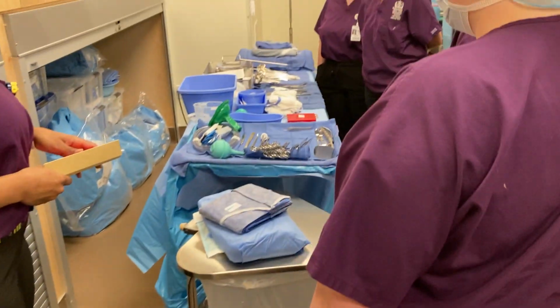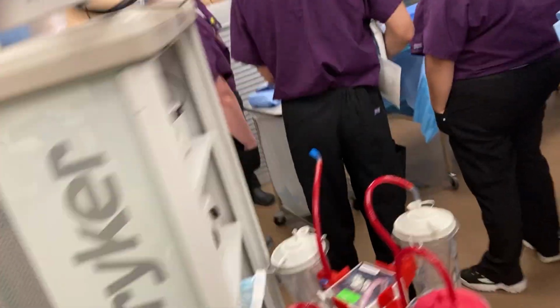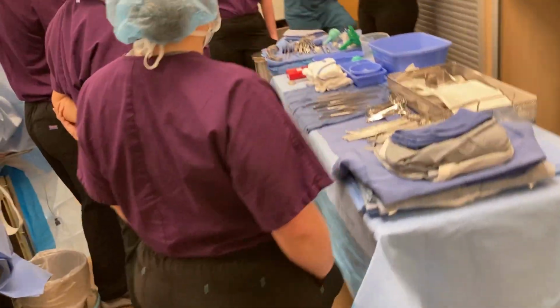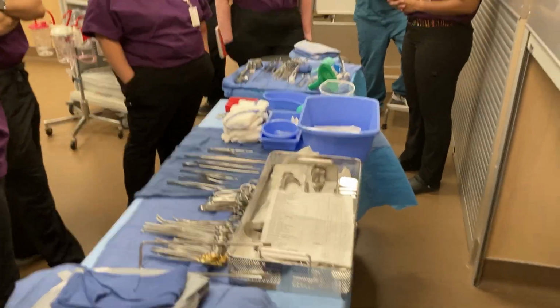All right. Now it's not truly an exploratory because we know what we're going to get into. We know exactly what we're going to do. Now, the right word is more of a laparotomy. We're doing a laparotomy. That is true, right? We're making an incision into the abdominal cavity.